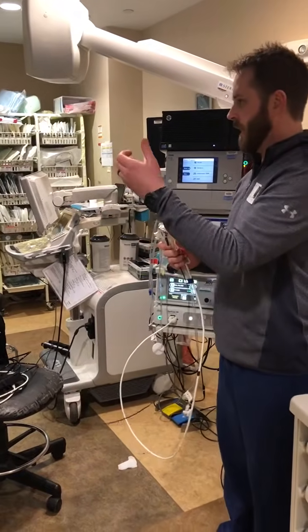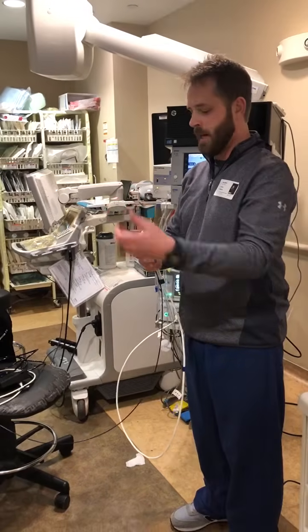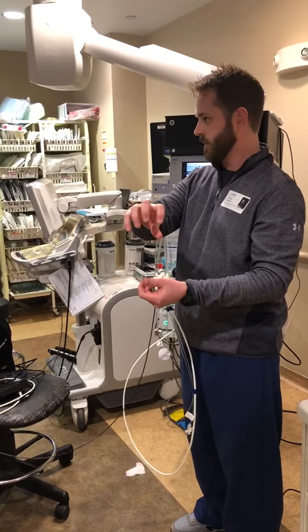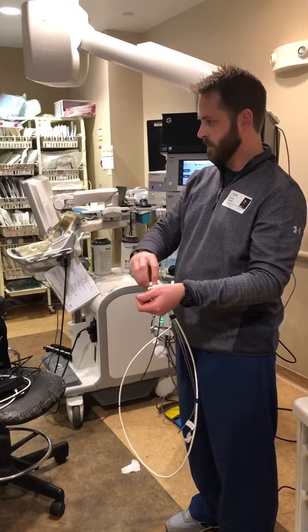Rastogi and Ollier are going to have their ERCP scope. This is going to attach just below the biopsy port. This is going to come out, stretch around, lock on the scope, and then they're going to have big dials up here for ERCP and little Spyglass dials down here. Okay. So you see the tip of the Spyglass scope?